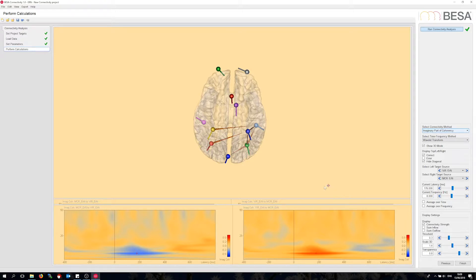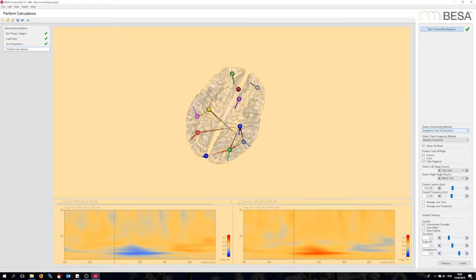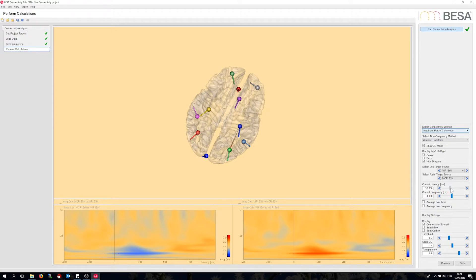Also it is interesting that the lateral visual areas drive the motor cortex here. If I go through the latencies, I can see how the connection starts at about 100 milliseconds after stimulus, then increasingly involves more sources, and goes off again at about 400 milliseconds.